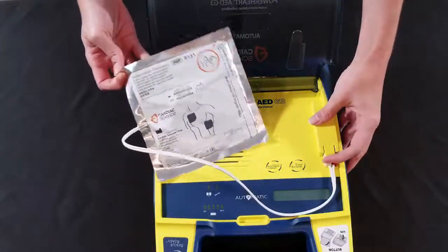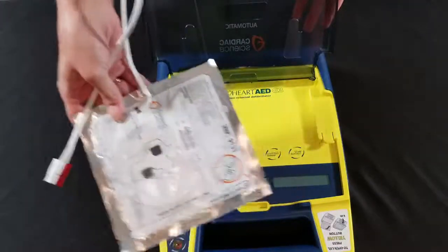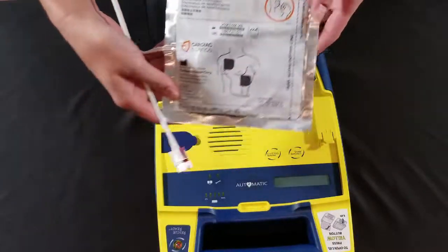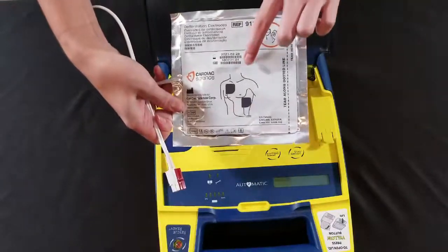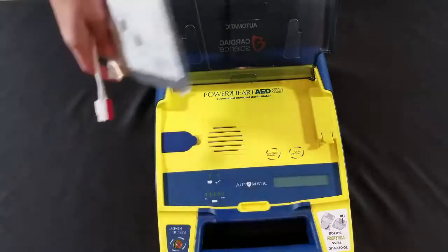Lift this yellow tab and pull. You can throw your old pads away. Take your new pads and slide them in with the little man facing you and the expiration date facing the lid.